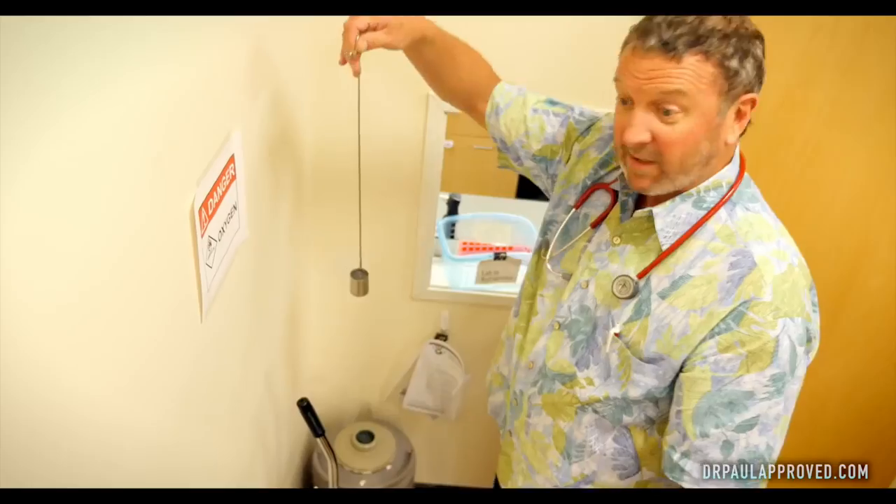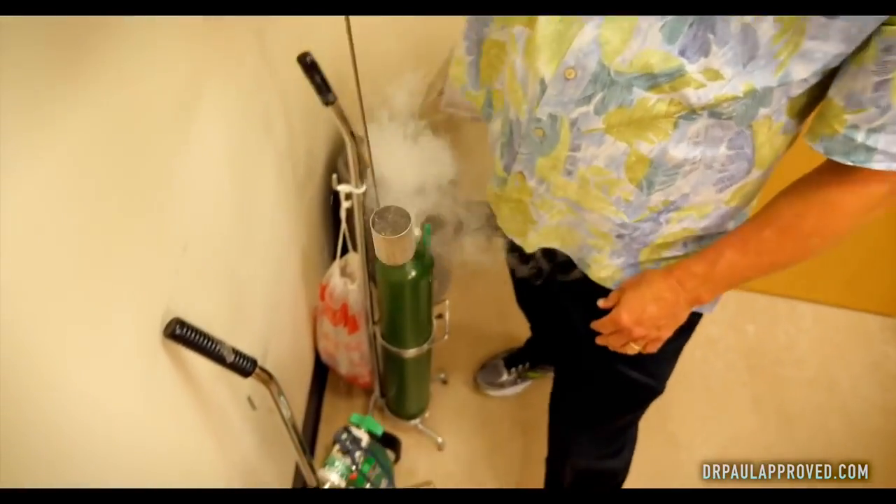We're gonna get some liquid nitrogen. This, folks, is liquid nitrogen. Do not try this at home.